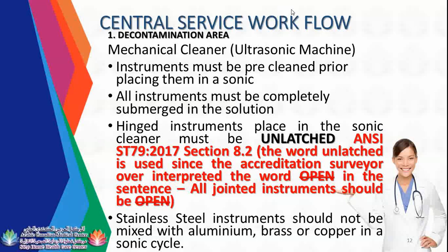Hinged instruments placed in the sonic cleaner must be unlatched. Before, guys, the word they used is open. If you see some instruments that have a lock, you need to unlatch those instruments. The simple term for unlatch is unlock.